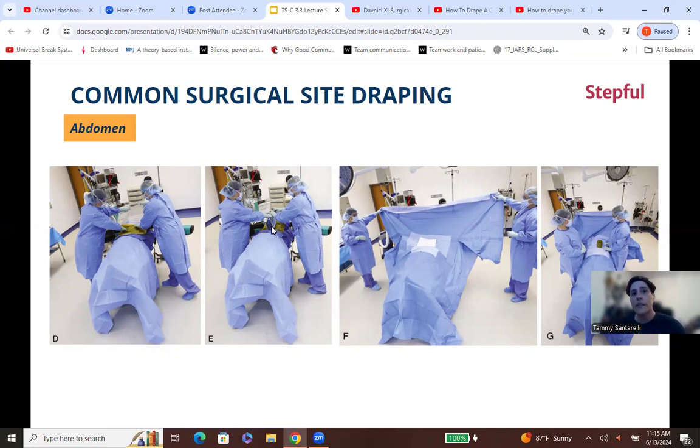Once you get the laparotomy drape open, you do feet first. See, look how long this drape is. And then you do head next, and they both have their hands cuffed, and you see anesthesia back here, or this is where anesthesia would be. And if they grab here or on the hand, they're not contaminating you because this is the underneath side, the non-sterile part. And then once that is taken by the anesthesia, you just drop your drape.